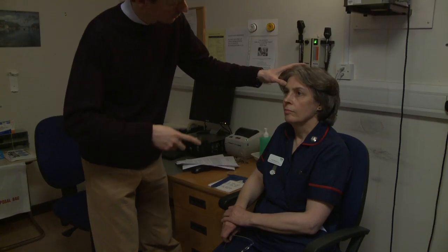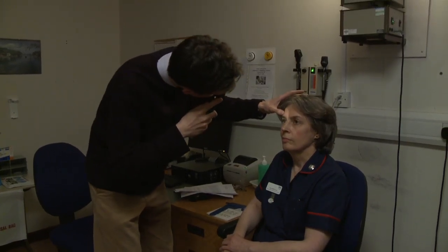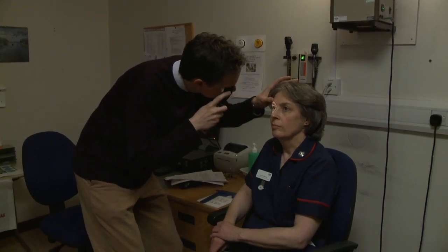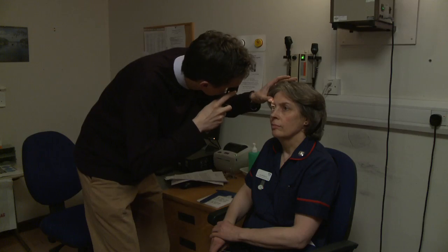With a plus 8 dioptre lens at 12cm, the anterior part of the eye should be in focus. Look for any shadows against the red reflex in the pupil which could represent, for example, either corneal foreign bodies or cataract.